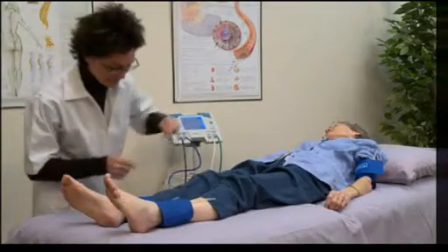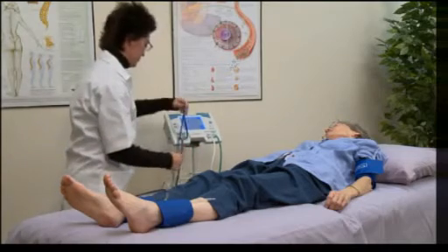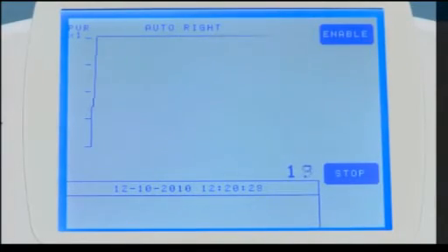After properly wrapping the cuffs, connect each of the hoses to the appropriate limb cuffs as labeled near the ends of each hose. Touch start on the system's ABI main screen to begin the exam. The cuffs will inflate and the Vantage ABI records the data as the cuffs deflate.